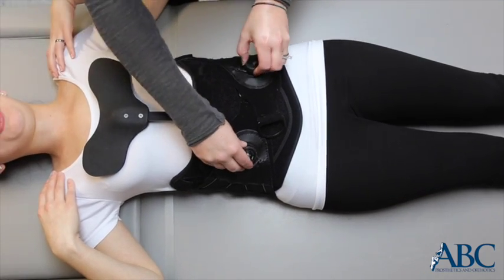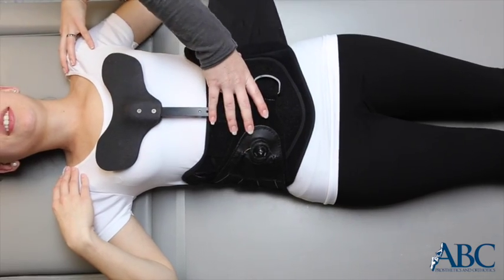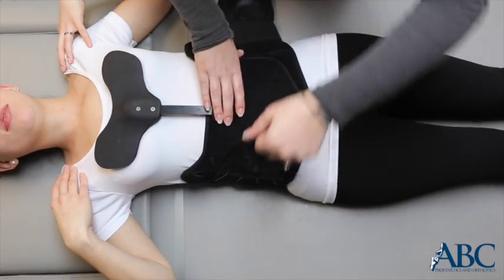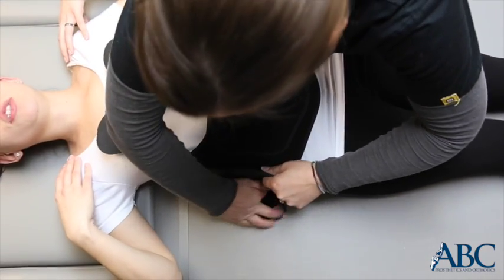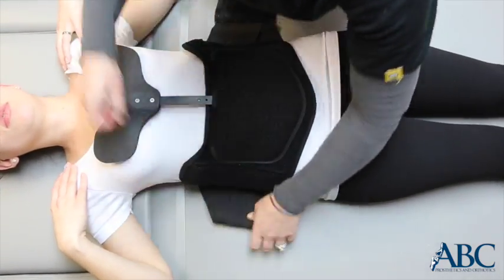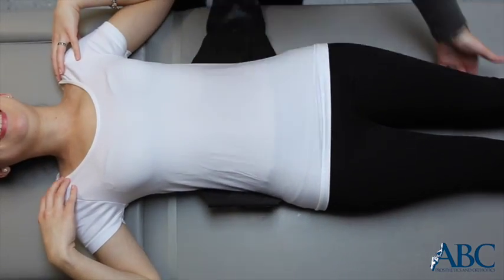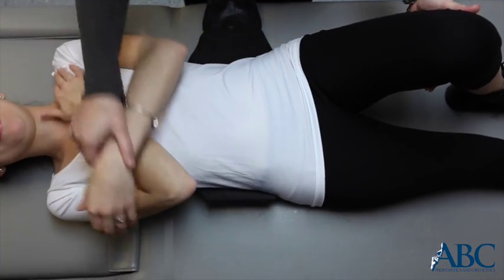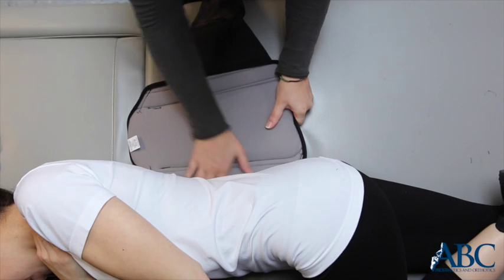Disengage the BOA system by pulling up on the knobs. Remove the Velcro straps and tuck under the patient's back. Remove the anterior panel and thoracic bar, or chest bar. Roll the patient onto their side and slide the back panel out from beneath them.